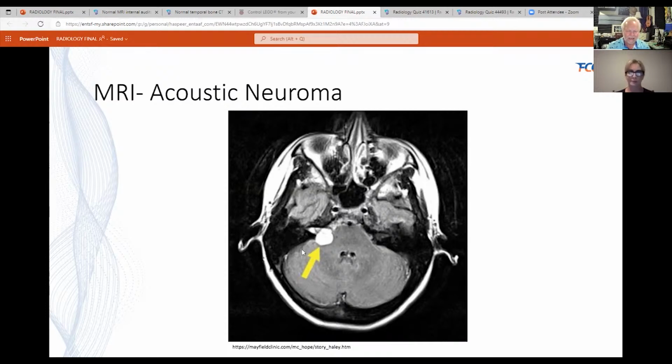And so here's an MRI, and this is a T1 image, not a T2. And if you were paying attention, you'll see that although this is the acoustic neuroma, it's sitting in the cistern, the posterior fossa, cerebellopontine angle, which is fluid filled, it's spinal fluid, but because this is T1 instead of T2, it doesn't light up nearly as much. So you know right away looking at it, if the spinal fluid's not lighting up, that it's a T1. And then they give contrast, and that's why this enhances so dramatically. Fat also shows up, these are the fat planes in the face and behind the eyes.